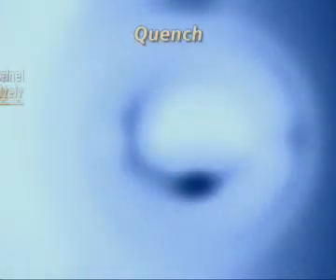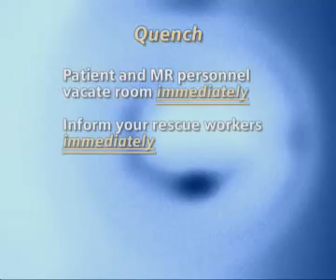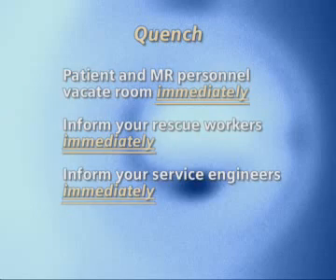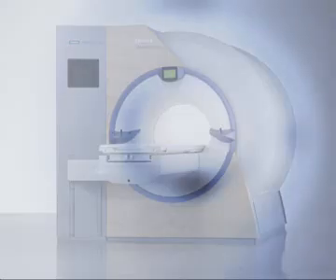Quench. Patient and MR personnel vacate room immediately. Inform your rescue workers immediately. Inform your service engineers immediately. For this reason, take the recommendations for operating personnel seriously and ensure regular maintenance of your equipment.